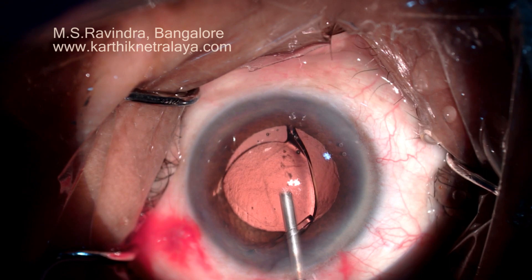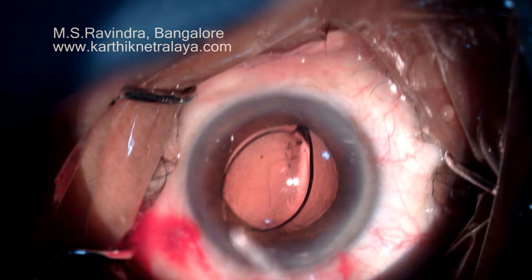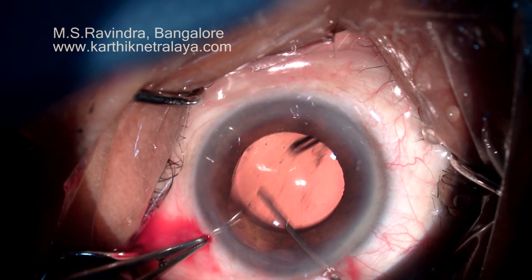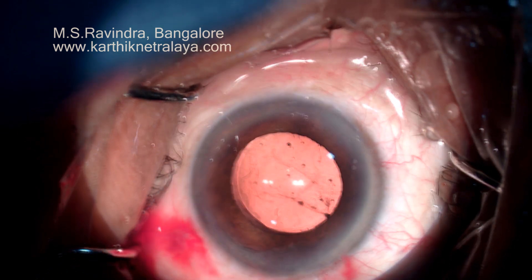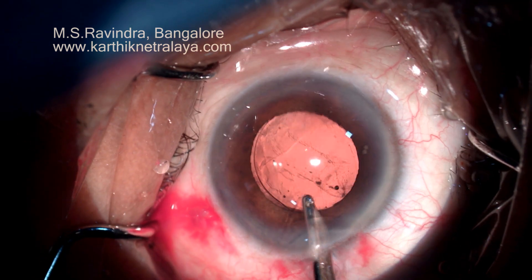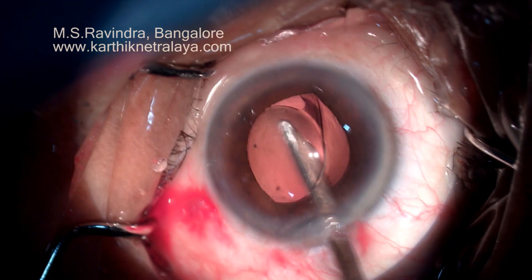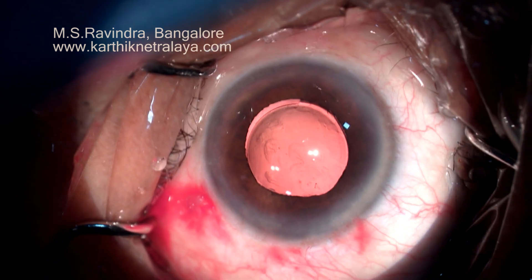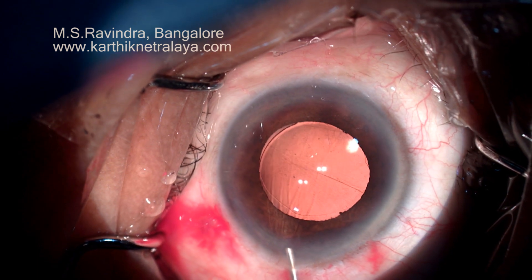The IOL is implanted into the capsular bag through the slit cartridge technique, which minimizes damage to the lens during implantation. The lens is positioned such that the haptic junctions are at the 3 o'clock and 9 o'clock positions. The entire viscoelastic from behind the lens, the anterior chamber, the angle region, and the posterior chamber are aspirated.